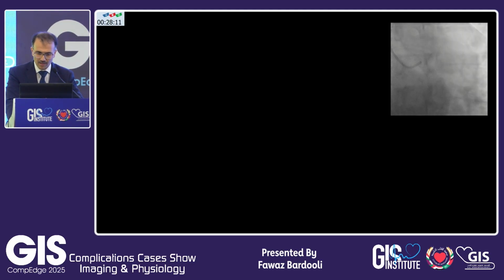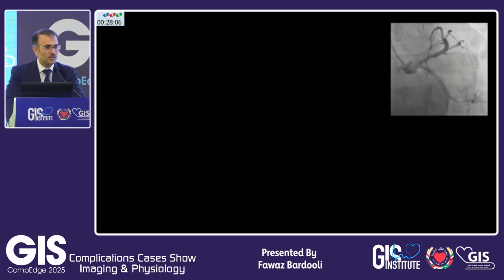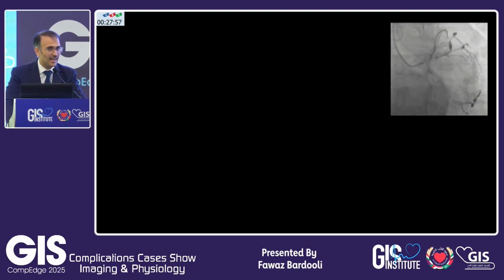So this is a day that I started with a patient having this angiogram. This is a patient who was having angina and was put on medical therapy, and on my table now, he's completely pain-free. There is a very ugly, I wouldn't say very, very ugly, but there is a lesion in the proximal LAD. Should I stent? And then a flashback comes to me. You remember your patient you stented last week. He had a stent thrombosis. And now he's pain-free, but this is very proximal LAD.